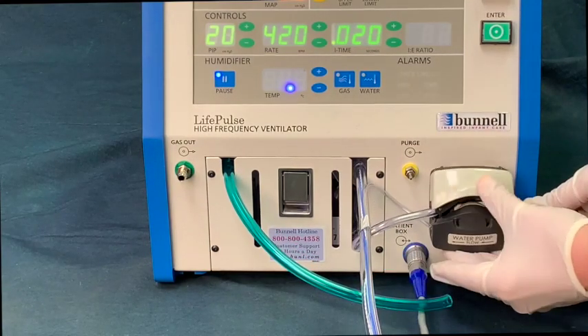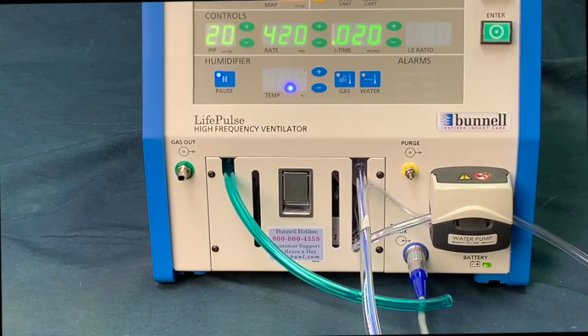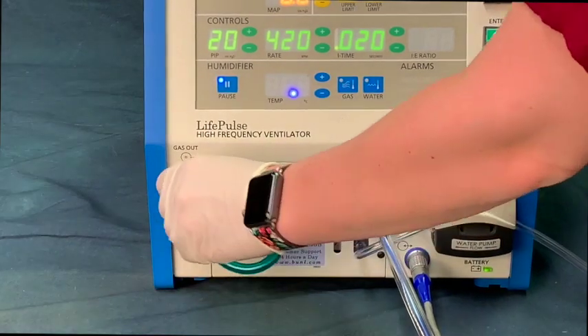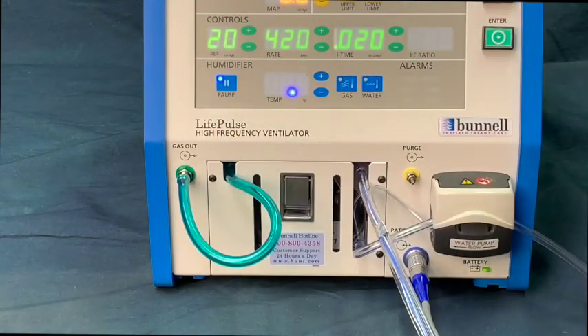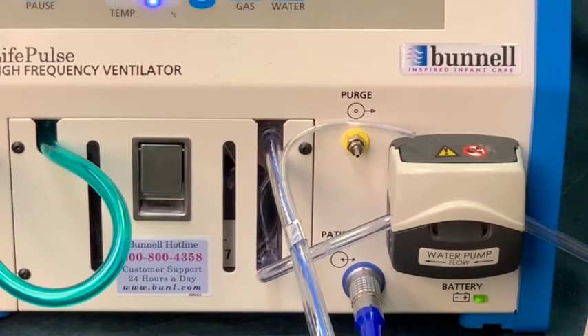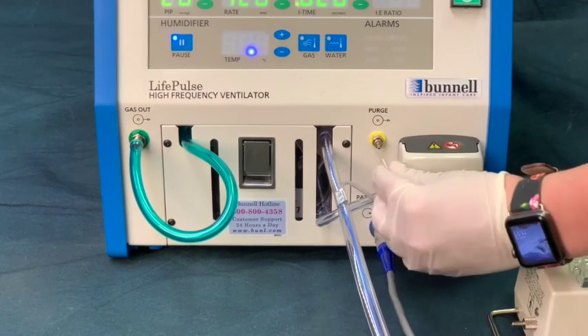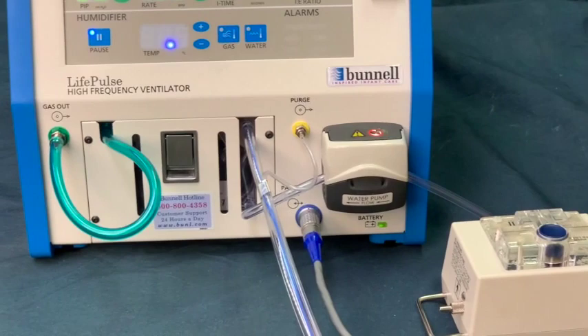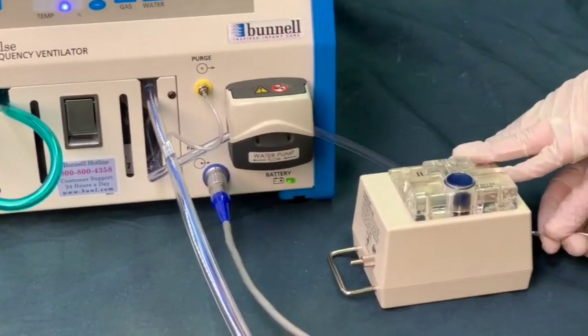Secure the water inlet tube inside the water pump and snap the pump door closed by pressing down on the upper portion. Attach the green gas inlet tube to the green coated gas out port on the Life Pulse. Attach the purge tube to the yellow coated purge port on the Life Pulse and attach the other end to the yellow coated port on the patient box.